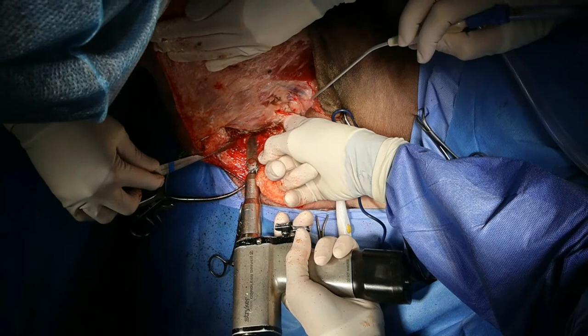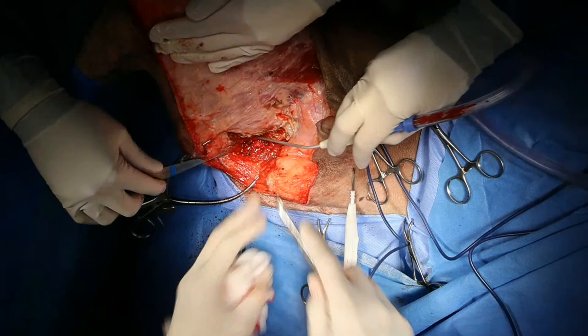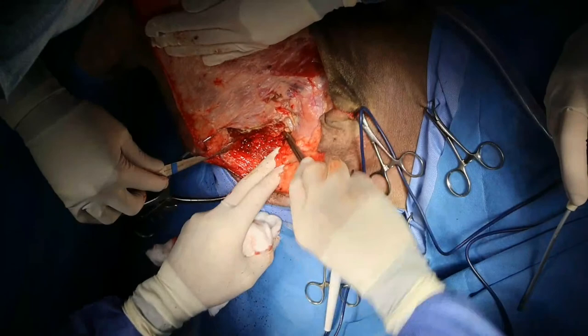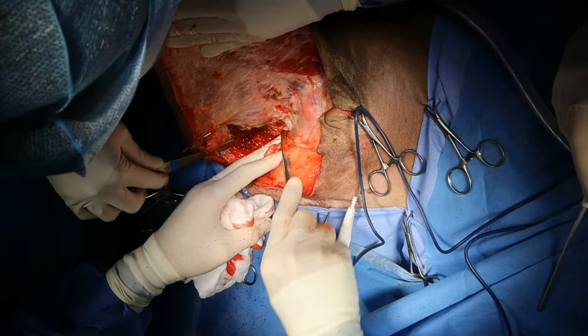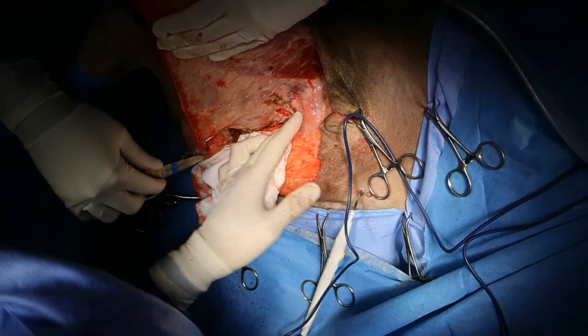So that's all the way through. And then I'll get some instrument, see if I can split that apart to make sure that that's completely released. So I don't know if you guys can see that, but that's completely separate. Okay. So now I'll just pack this off. Now I've got the prepubic tendon right up here against the pubis.